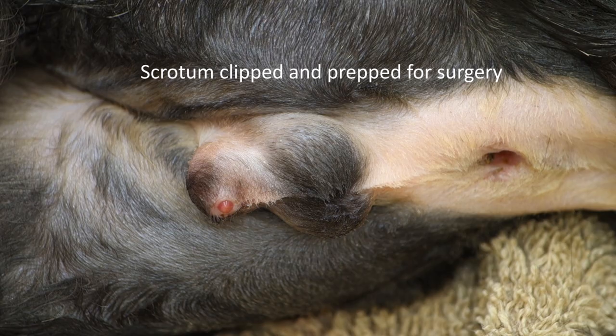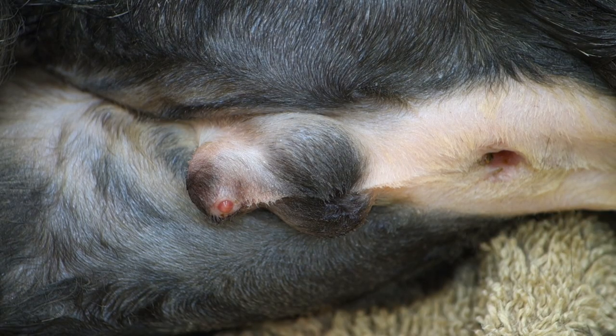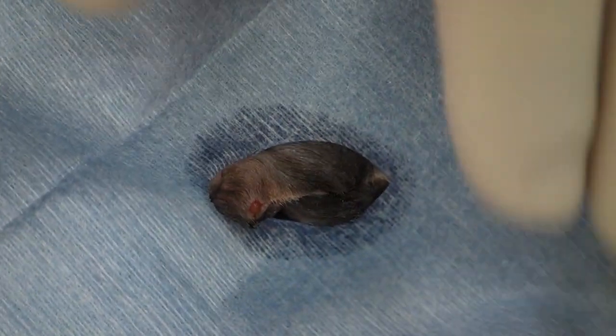Today we're going to perform a closed castration in a young cat. We've prepped and scrubbed up the area and have now applied a disposable drape.